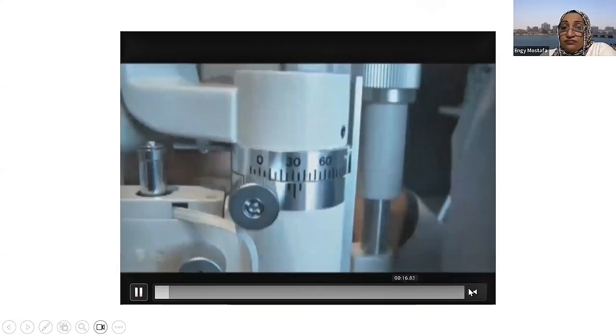So this is the normal situation. Now we are changing this situation. That is how we decouple the light. See, from this knob, we are decoupling. So instead of looking at this point, we are trying to put the light at the limbus here. How do we decouple it? Let's go back through this part, through this knob.